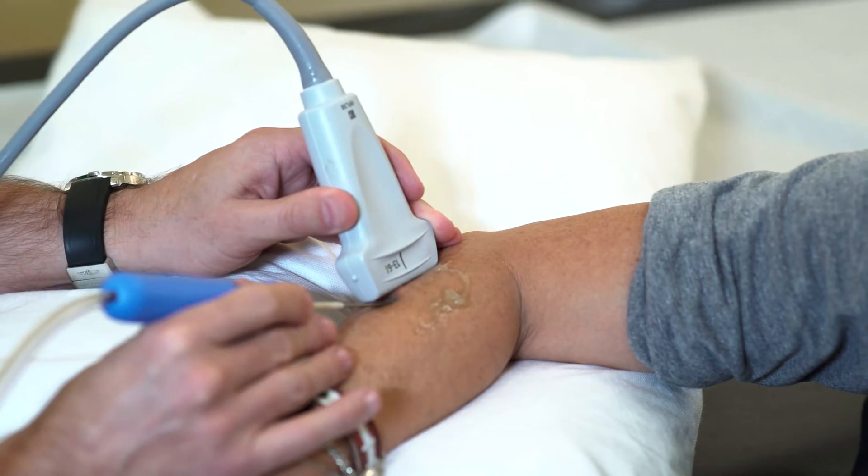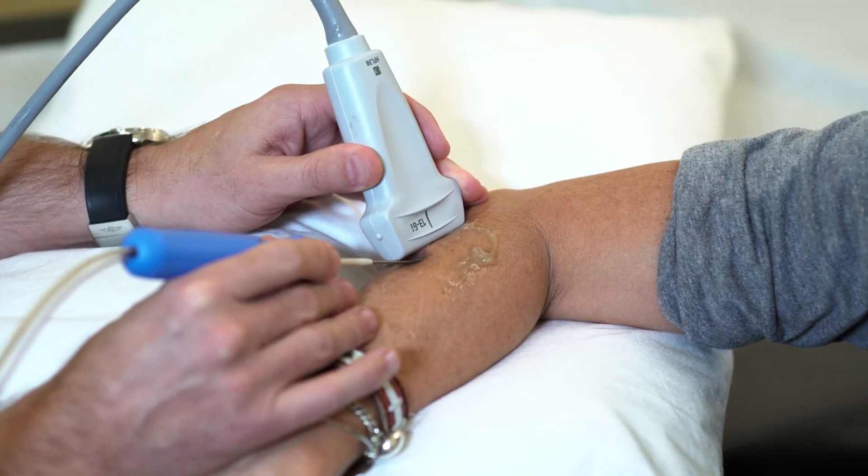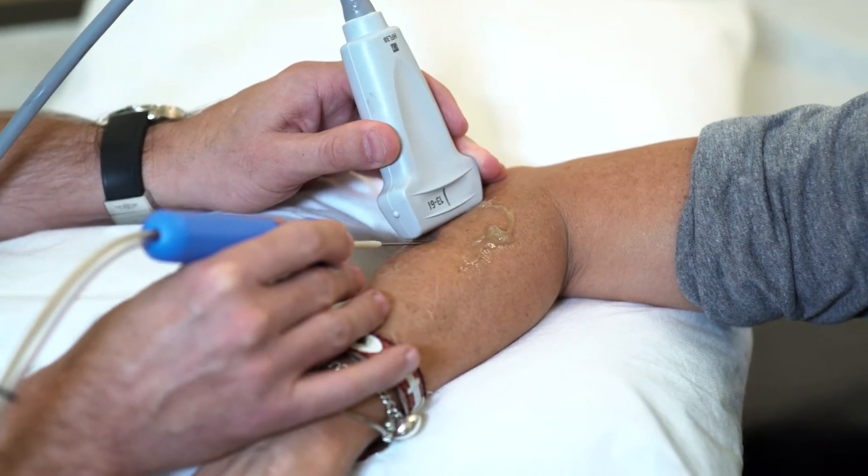What's great about this procedure is that for years we had no real answer to the chronic tendon problem. People would come in and say their elbow hurts or their knee hurts, and the answer was always to take anti-inflammatories, use ice, rest it, and maybe in six to eight weeks things would be better. When this process came along that was this simple — treating tendons directly — I was very excited to get involved. The device is applicable to several different locations of the body, which is important since nobody gets to choose which tendon they injure. Plantar fasciitis, for example, is a common and frustrating injury seen in runners. My wife is a mini-marathon athlete and it really sidelined her, so being able to treat the plantar fascia with a simple procedure has been very rewarding.